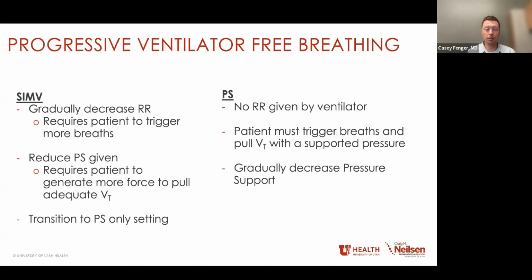Then we can reduce the pressure support that's given for those breaths that they individually trigger. So there's a lot of tinkering that can be done on this SIMV mode, reducing the respiratory rates and reducing the pressure support. So when someone is ready to graduate from SIMV, they no longer have a set rate for the volume control. Then we transition them to pure pressure support. This requires patients to pull all the breath on their own, and we can give them pressure to help them. And then over time, we gradually reduce that pressure.